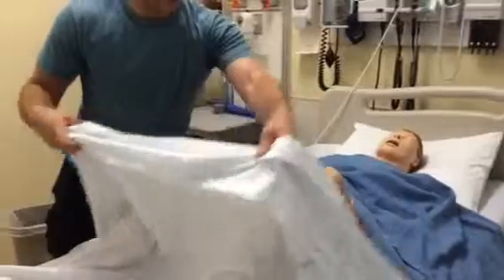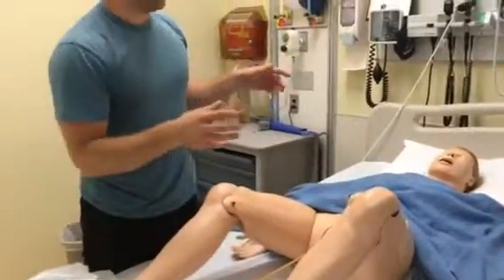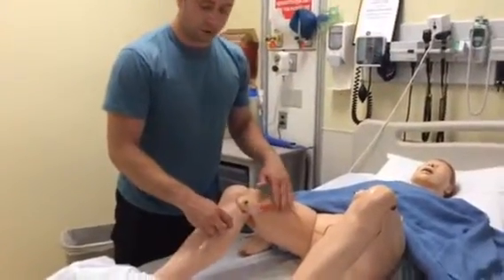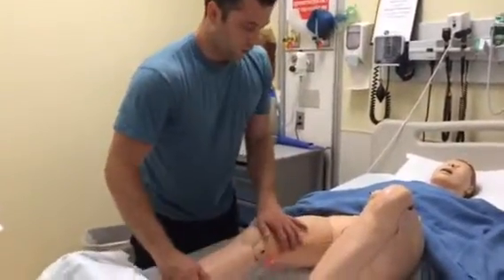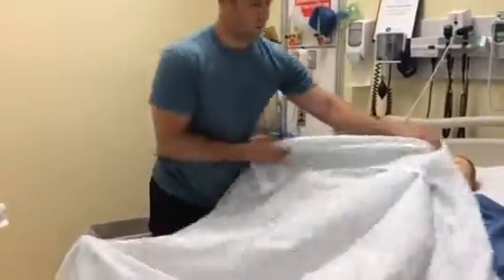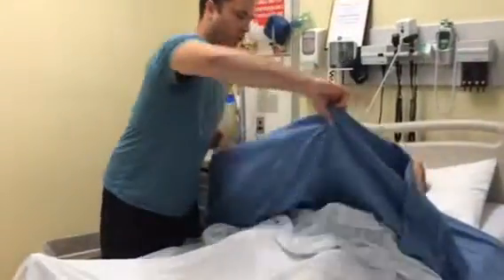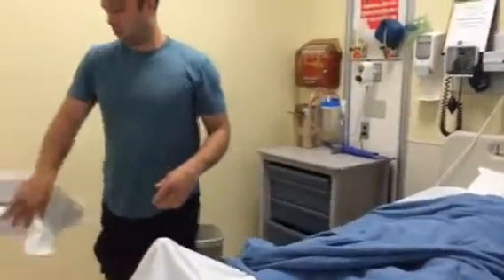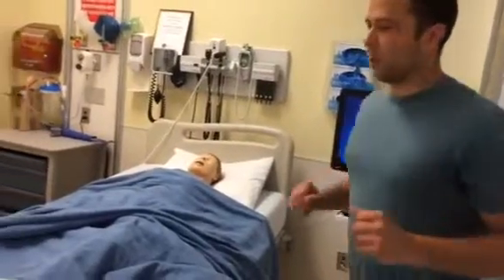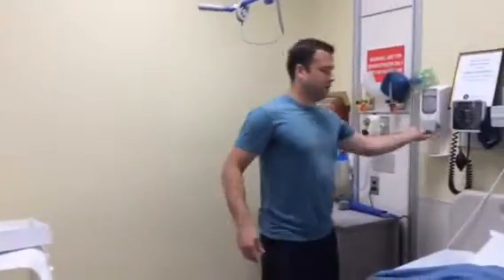Oh, and there's one thing I forgot to do, which is to attach the Foley to the leg here, which I would do with sterile gloves. So we pull that back down. And the last thing I would do before removing is document. We'll be all set. Hand hygiene one more time, and I'll be on my way.